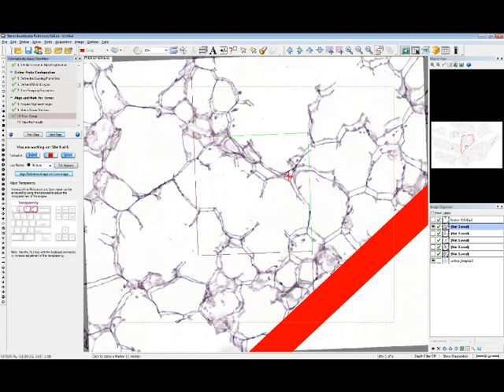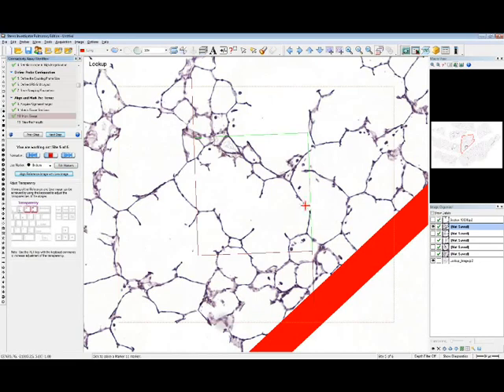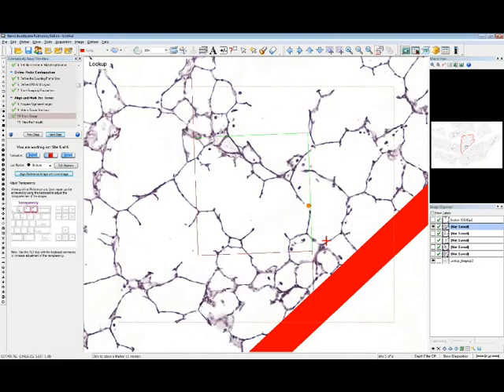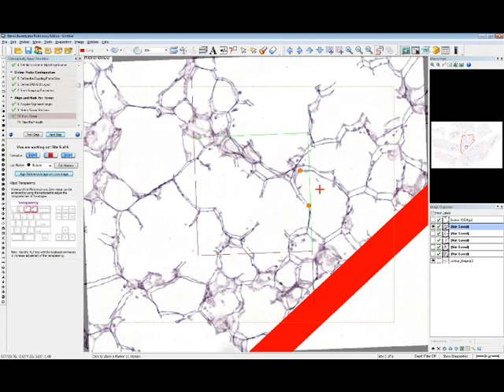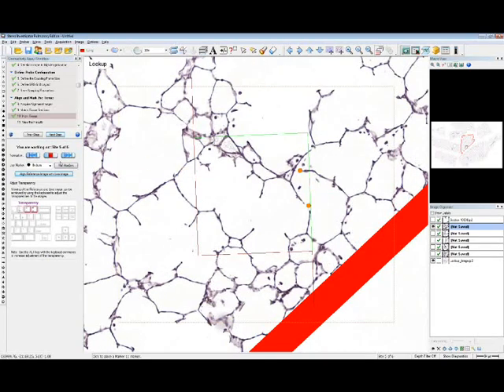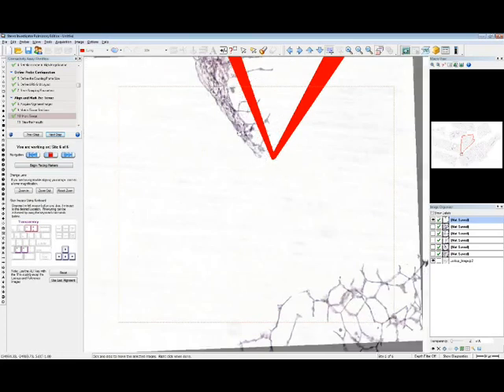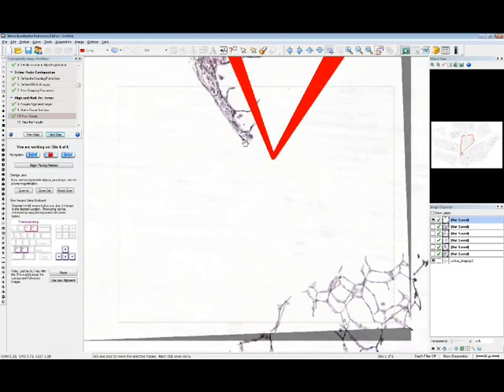And let's go in here and look again. So we have over here, look up, there is no bridge, but there is a bridge on the next slide over. There is another bridge here. And I think this is it for us for bridges on this dissector. We'll finally go to the last one, and it looks like we're not going to see very much at this very bottom here, but we'll line it up.